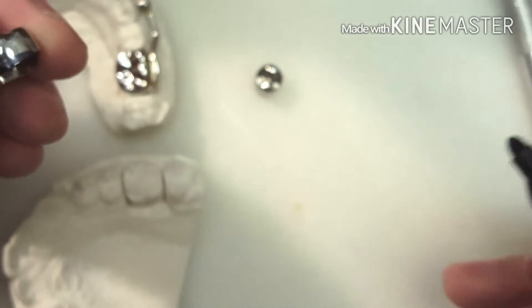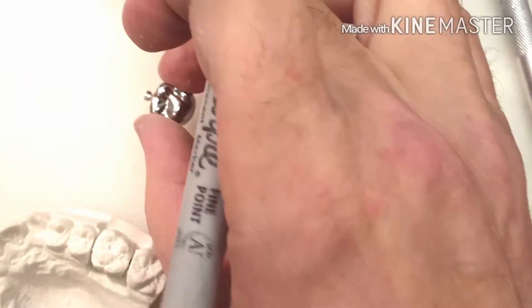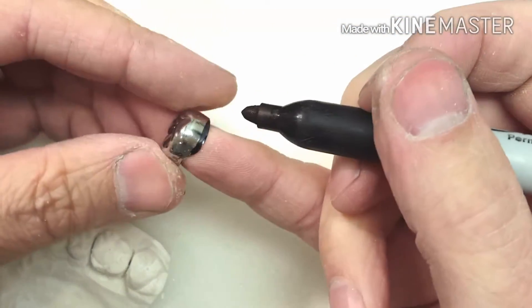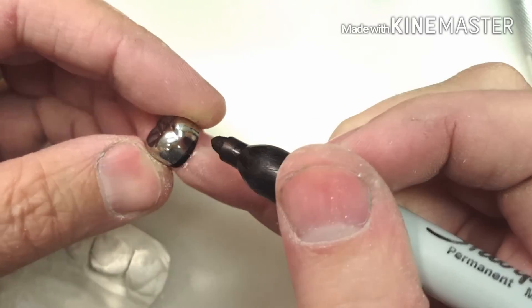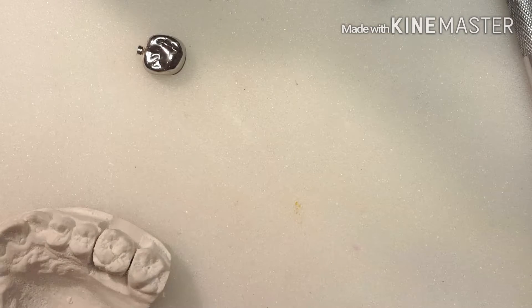What I've learned over the years is that when you cut this off, it becomes very, very sharp. So you need to dull it out, and the key to doing this is to use an e-cutter.